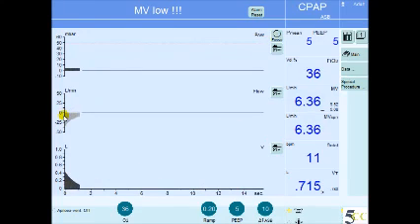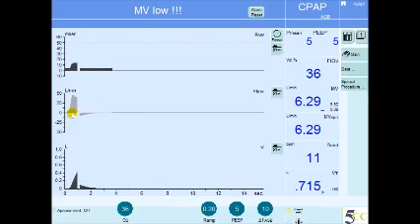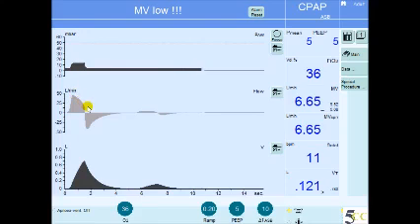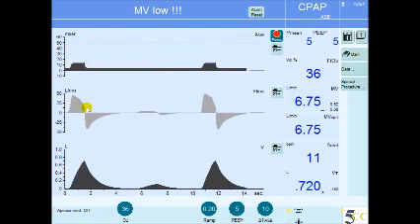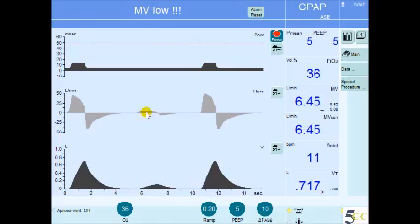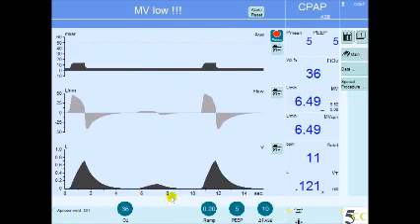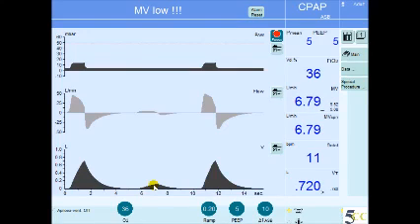We'll see it once again: all the breaths are initiated by the patient, the machine is triggered and gives 10 centimeters of water, the flow is decelerating and ends at 25% of the maximum flow. It's worth noting that this one breath was initiated by the patient but did not trigger the ventilator because it did not reach the threshold of 5.7 liters per minute — that's why it ended up with a very minimal tidal volume. With this, I'd like to end this five-minute critical care concept, and I look forward to seeing you in one of the next sessions. Thank you.